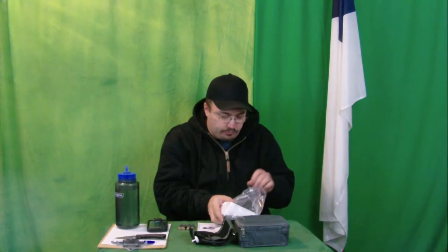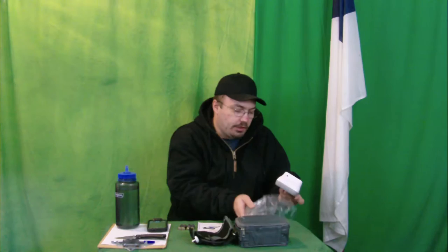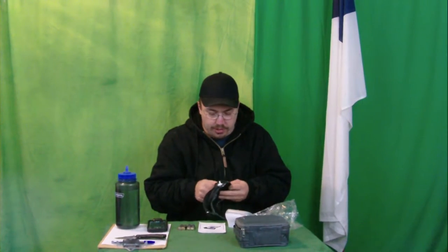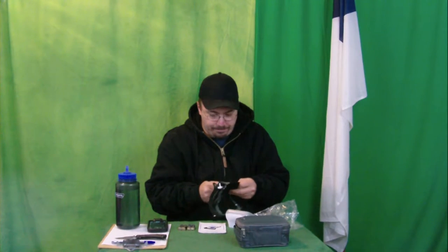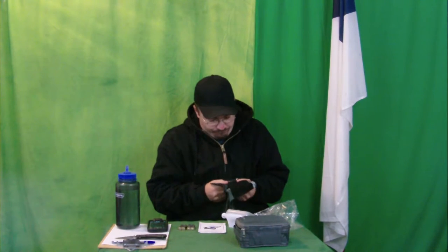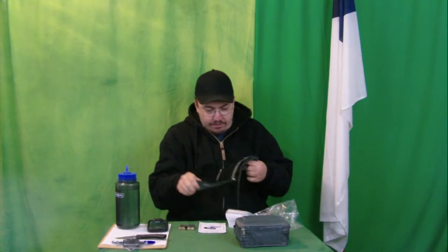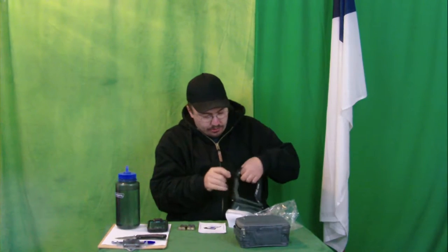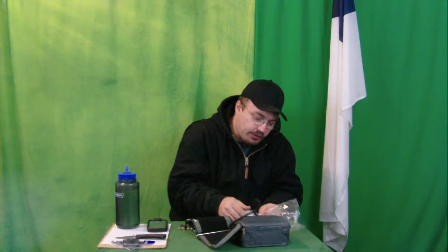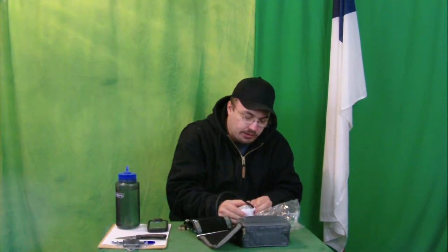We're going to open this up. I think we want to hook it up before we put the batteries in it. So I'm not reading the manual at this point until I have to. We're going to stick this into the side of the flux capacitor — because this is what makes time travel possible, right here. Then we're going to install our batteries and that should be it.